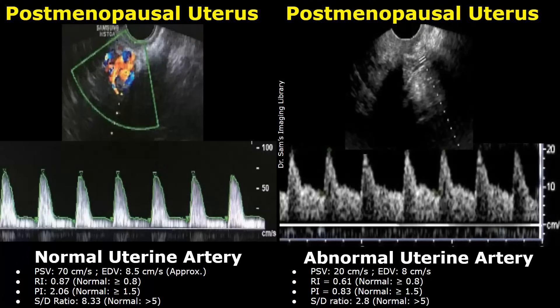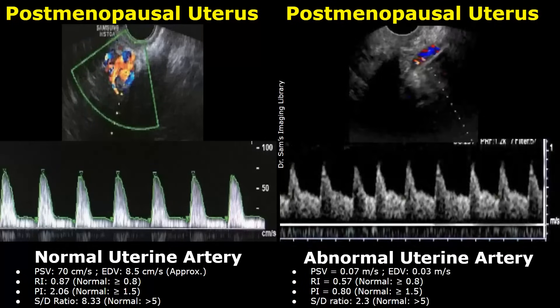This case shows an abnormal uterine artery spectral Doppler waveform in a postmenopausal patient. The resistive index is 0.61, which is abnormal because it is less than 0.8. The pulsatility index is less than 1.5, so that is abnormal, and the SD ratio is also less than normal at 2.8 — so these values are abnormal. Here is another case showing abnormal uterine artery spectral Doppler values, where the resistive index, pulsatility index, and SD ratio are all abnormal.